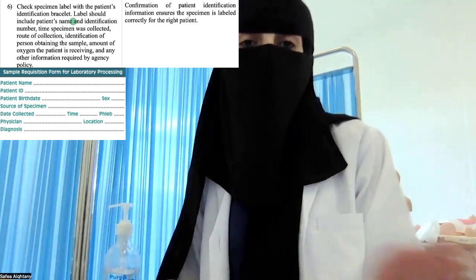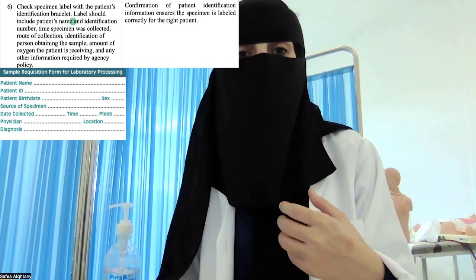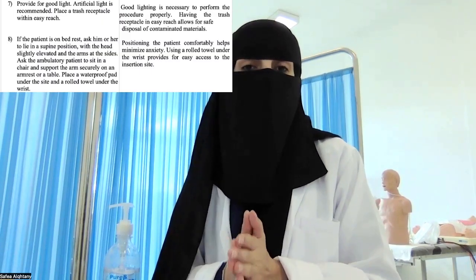طبعا مهمة هذه المعلومة جدا، لأنه لما يكون البيشنت على أكسجين ممكن يغير لنا في نتيجة أو في value of the ABG. فمهم إنه أضيف كمان إذا كان هو على oxygen and how much he is receiving. I need also to check the name of the healthcare provider, which is, for example, me, the one who will obtain the sample. According to agency policy also, if they want extra information, we can obtain this information at the beginning. After we check with that, we need to place the patient in a good position in order to obtain the sample.